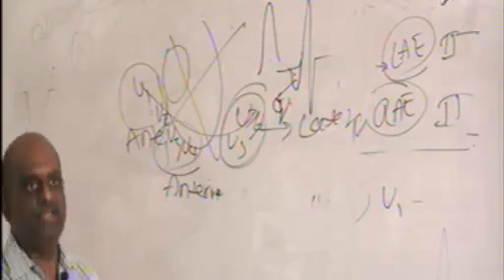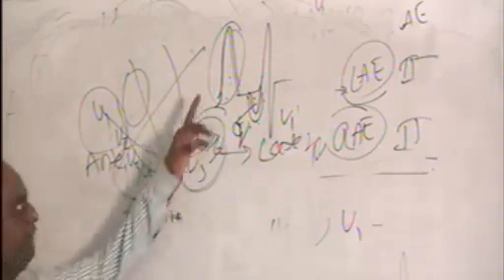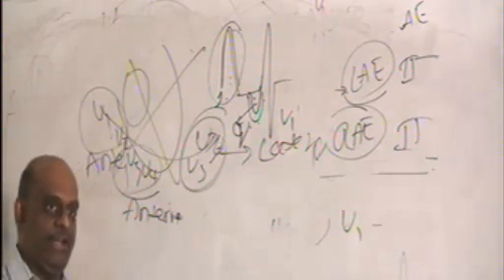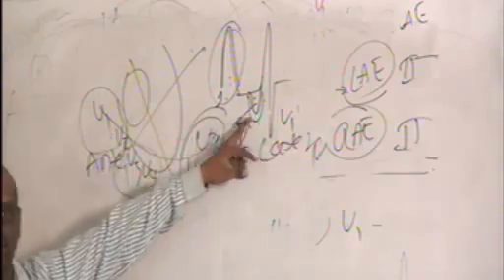Reciprocal is R. So instead of producing a negative Q wave in the lead V1, you find a positive R wave in the lead V1, which is a reciprocal change, which is similar to Q wave. The posterior wall reflects as an R wave in the anterior wall lead. That's the reason if R wave is there in the anterior wall lead, normally will V1 contain R wave?